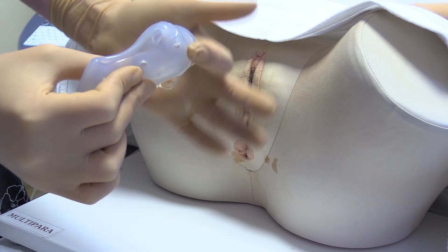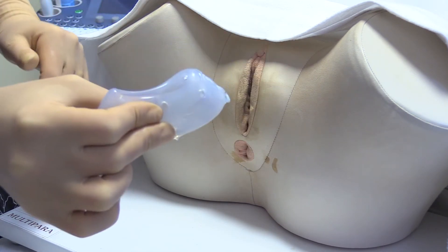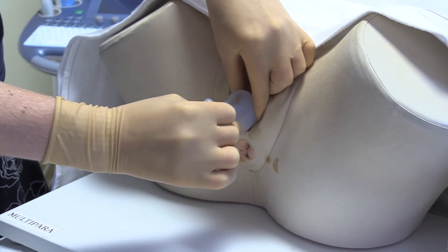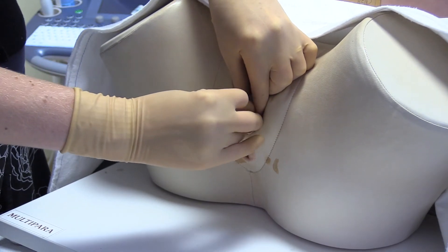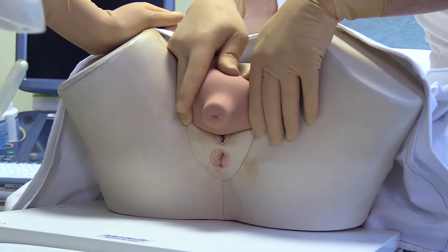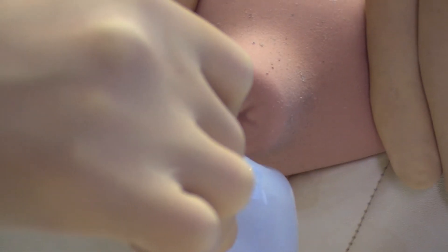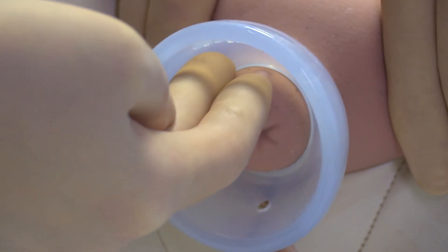Lubrication gel is applied to the end of the pessary. The labia are parted and the pessary gently advanced into the vagina, aiming for the posterior fornix. To insert the pessary, it should be advanced and released to unfold under the cervix. Without removing the examining hand from the vagina, the fingers are withdrawn slightly and the central portion of the pessary dome is examined.